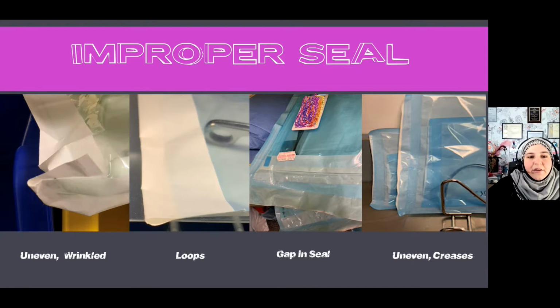So now we're going to talk about our seal, right? When we're talking about self-seal pouches, we want to make sure that we're doing that seal correctly. We were going over a little bit about the importance of a seal, right? And so an uneven, wrinkled seal: you can see on the very far left that the seal did not go flat and even. It's actually overhanging on one side, and we're going to talk about why that is.